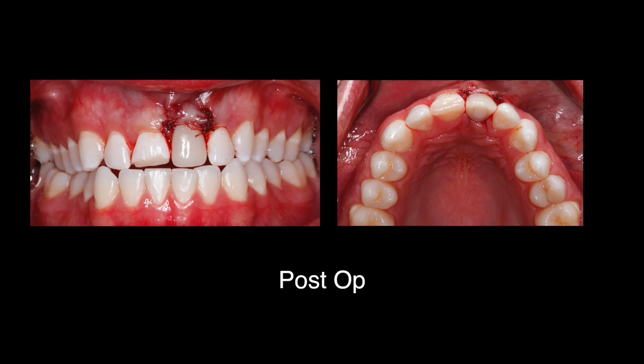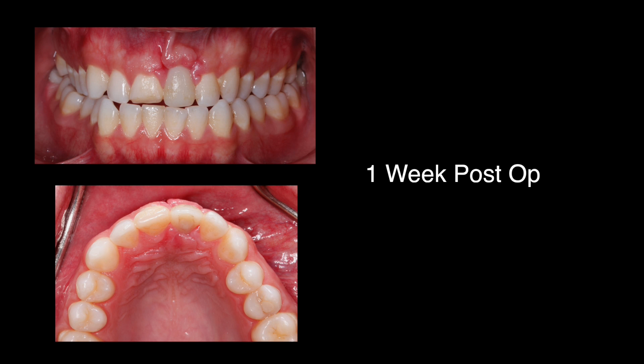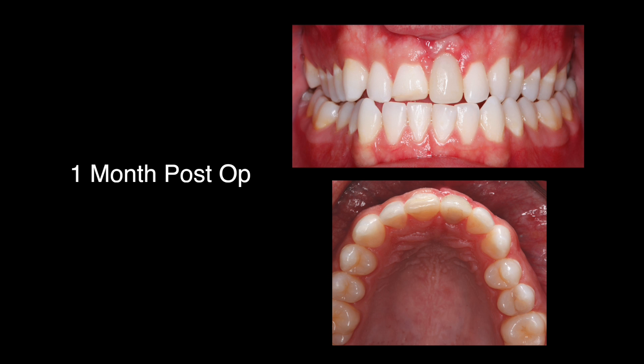This is how things look at the day of the procedure, and then one week later the tissue is starting to form. Over the next several months, you can make adjustments to the temporary to help the tissue move up or down depending on the contours of the temporary.